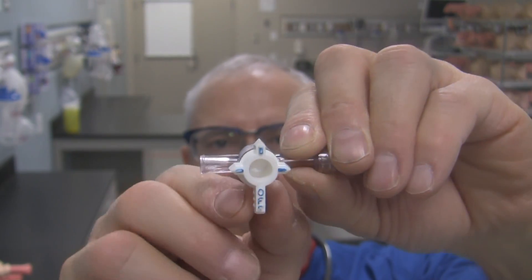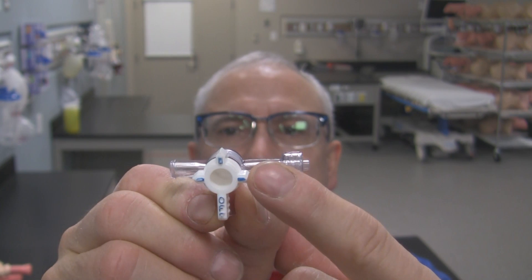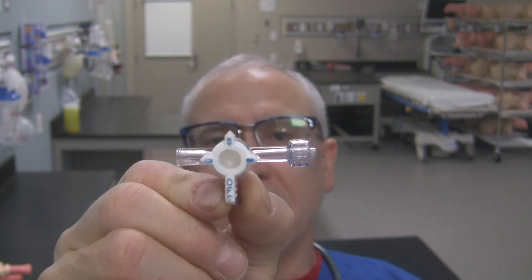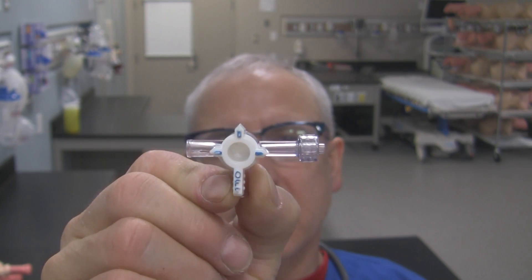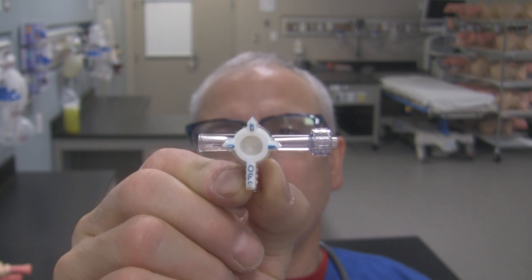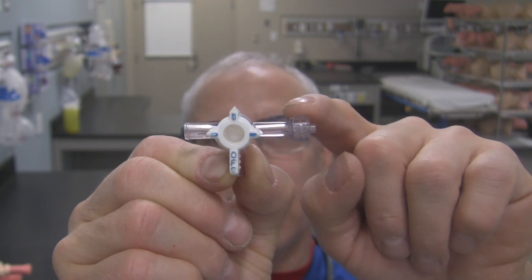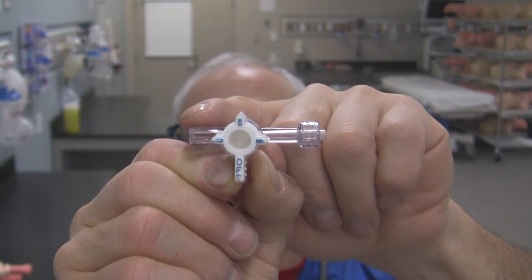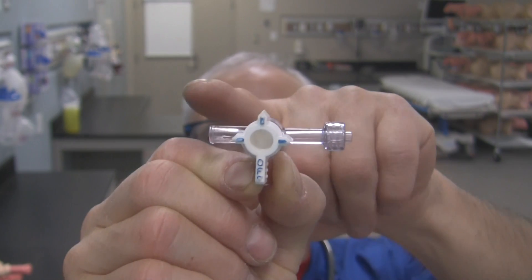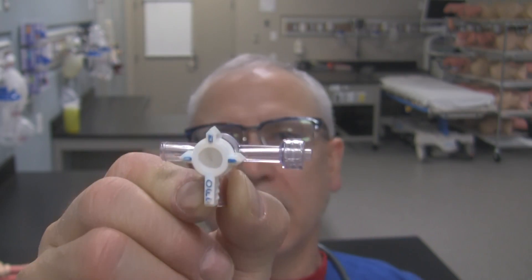The ports that don't have the off tab pointing to them are potentially on. Can you confirm that they're on or communicating with each other? Take a look to see if these little alignment pieces that have the little blue on them — if they're pointing to the ports, it means those ports are in fact open. So in this configuration, the port down here is off, the male end right over here is open, and this female end is also open. So gas or liquids could go right through the stopcock in that fashion.